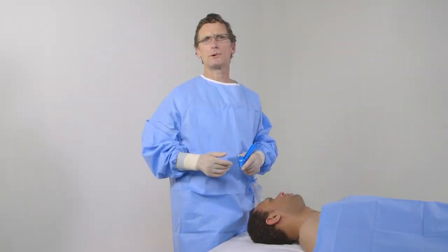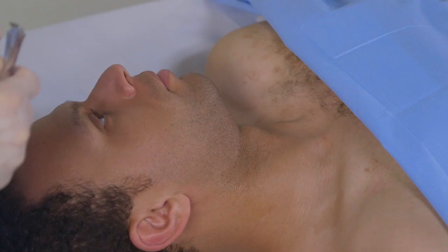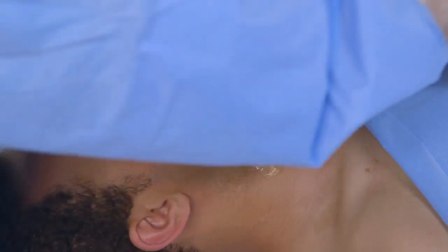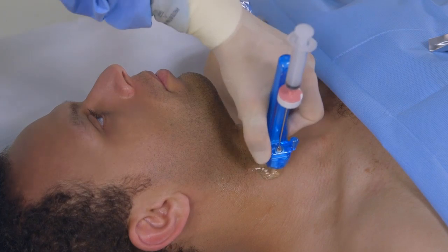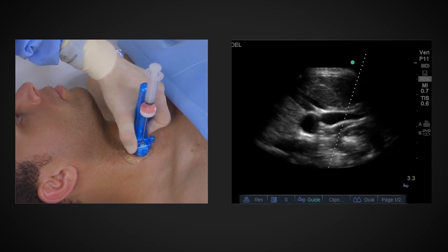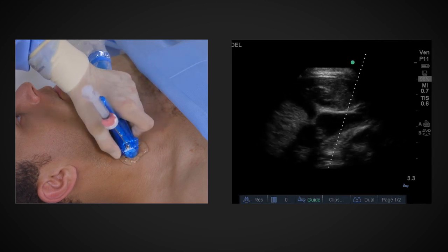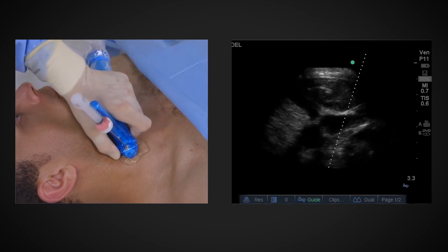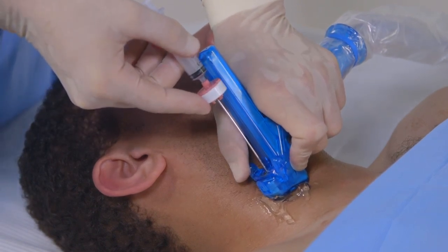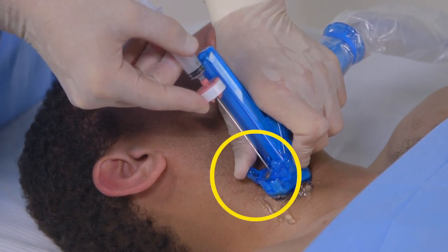Now, I will show you on our model how I perform an internal jugular vein central line using AxoTrack. With the patient optimally positioned, apply a liberal amount of sterile gel and place the probe over the internal jugular vein while maintaining gentle pressure on the needle clamp. Align the on-screen target line with the internal jugular vein on the sonogram. Angle or tip the probe about 30 degrees downstream. Hold the needle assembly and syringe approximately as shown. Release the needle by rotating the needle clamp fully forward with the thumb to the open position and prepare to advance the needle.